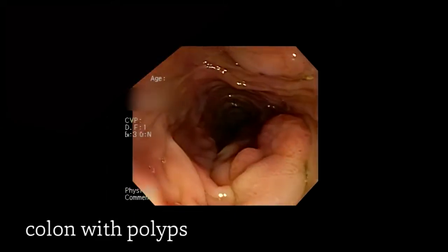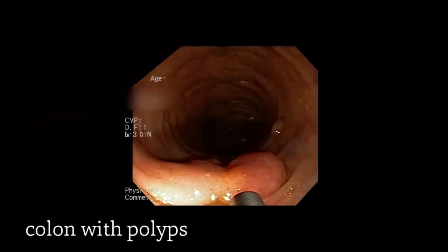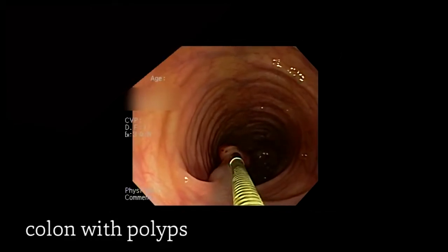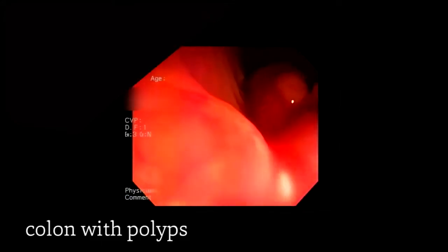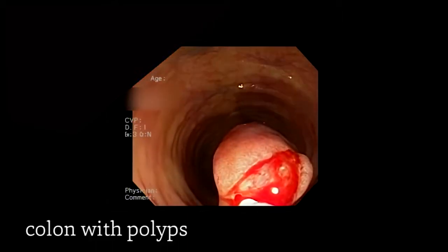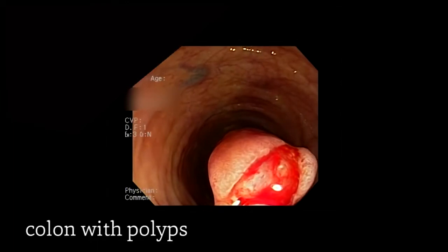Now you'll notice two very large polyps here, one at 12 o'clock and the other at about 6 o'clock. Before removing this large polyp, we chose to inject epinephrine to ensure that we minimize bleeding from removal. Then, similar to the smaller polyps, we snared the polyp, but in this case we chose to actually choke the polyp for a while until we saw a color change and were confident that we had choked off the blood supply before removing it.